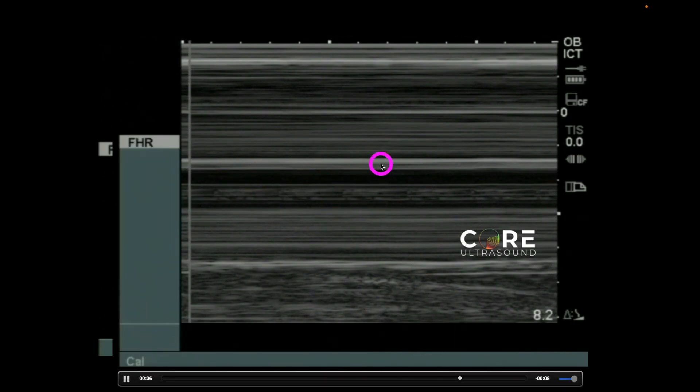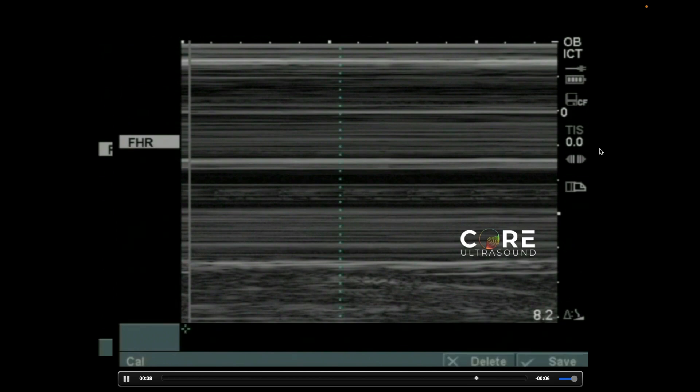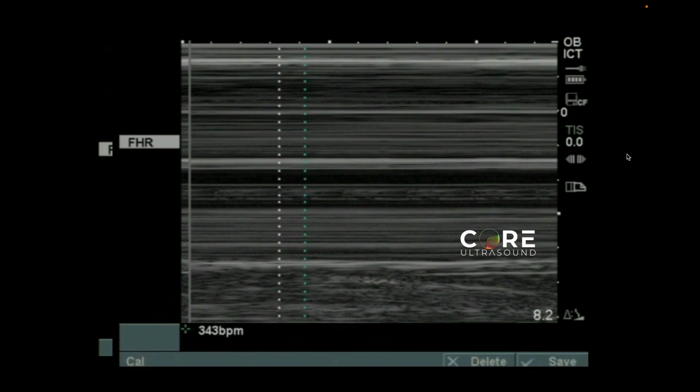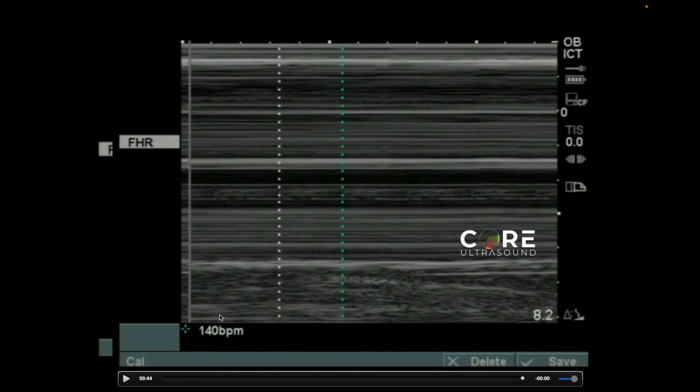Now, this waveform — you can see here a repetitive pattern right here and right here. This is the fetal heart rate. Next, hit your calculators or calculation button. Identify the beginning of one of those heartbeats and the next heartbeat, and you'll get a fetal heart rate. It's that easy.